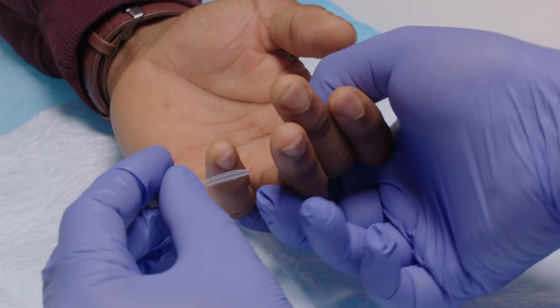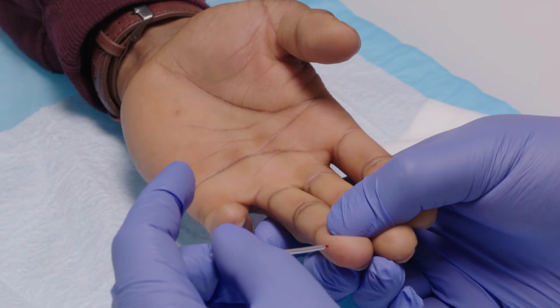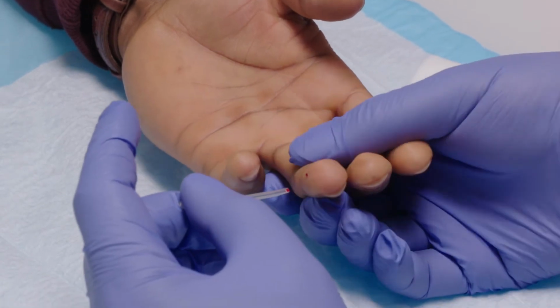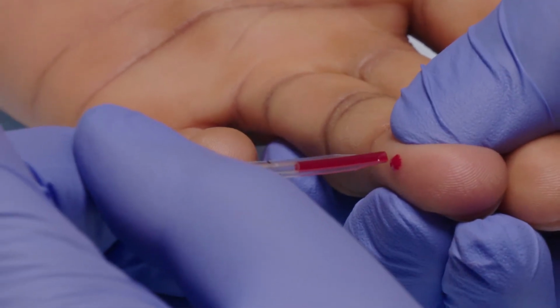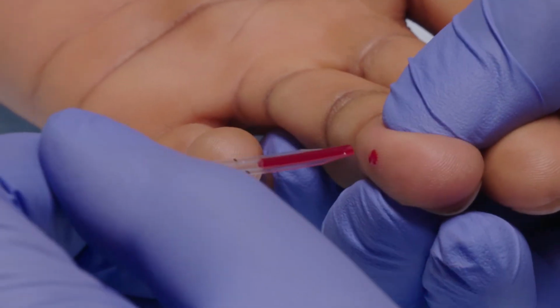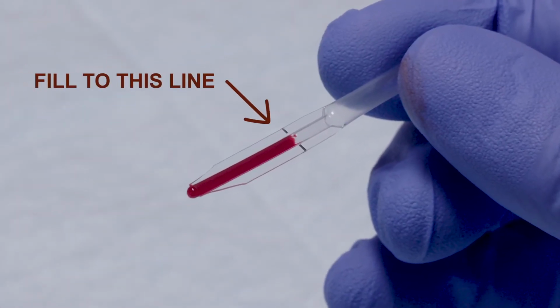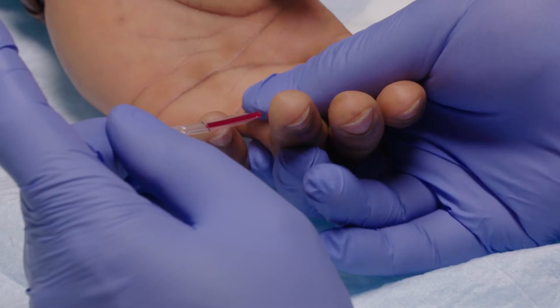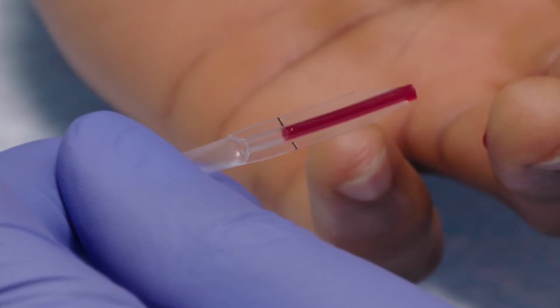If necessary, squeeze down the length of the finger up to the top joint and stop before the fingertip to encourage more blood flow. Collect the second drop of blood by holding the capillary tube horizontally and touch the tip of the capillary tube to the blood sample. Maintain this position until the flow of the sample has reached the fill line and stop. Fill the disposable capillary tube to the line to ensure the correct amount of sample. Watch carefully while filling the disposable capillary tube as the sample needs to come to that line exactly. Not enough blood or too much blood could result in an invalid test.